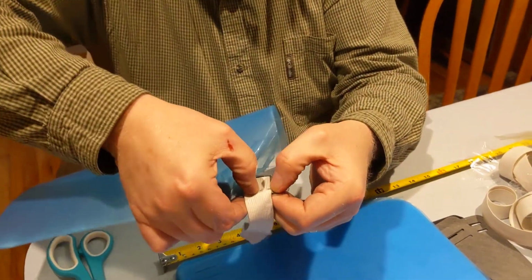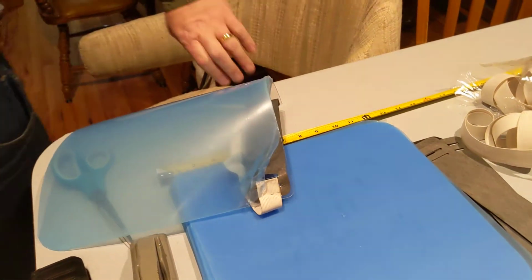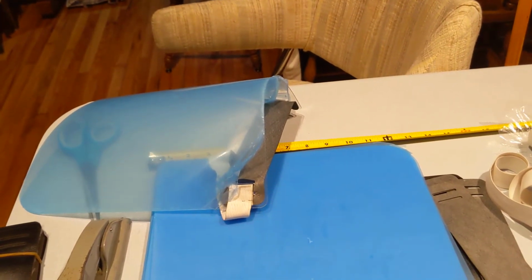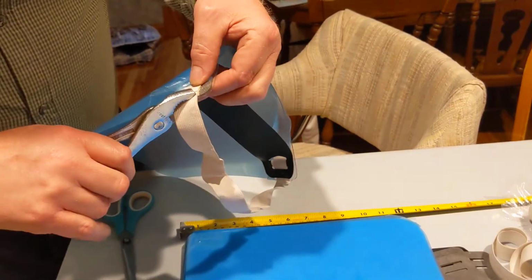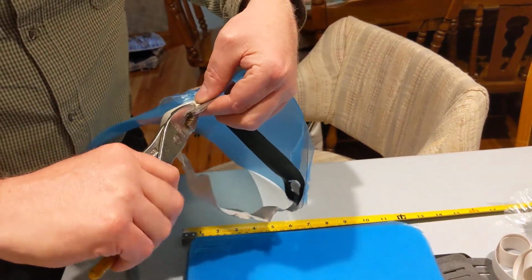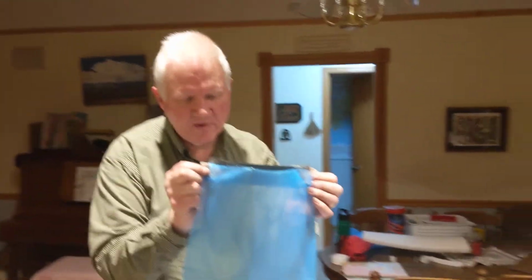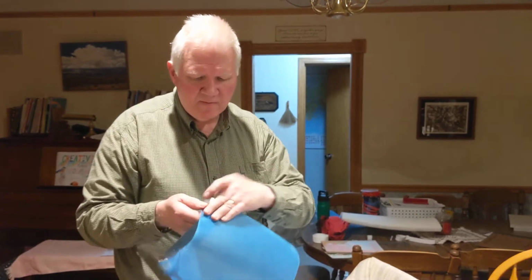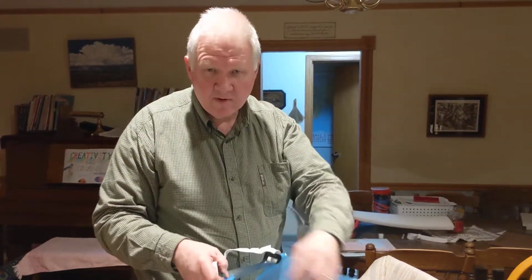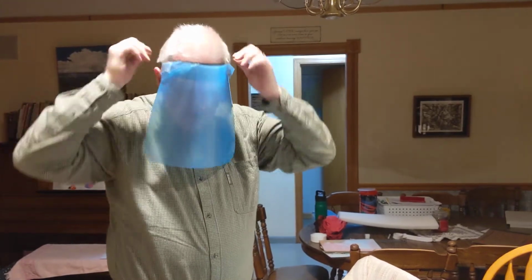If you have any of the pins of the staple that don't press in firmly, you could use standard household pliers to press those down, but since it's facing away from the face, they should not cause any problem. They don't even feel sharp to my finger at all. Then when the medical personnel are ready to use the face shield, they can peel away the protective film from both surfaces, the inside and outside of the face shield, and then simply put the vinyl headband against their forehead, and it's ready to use.